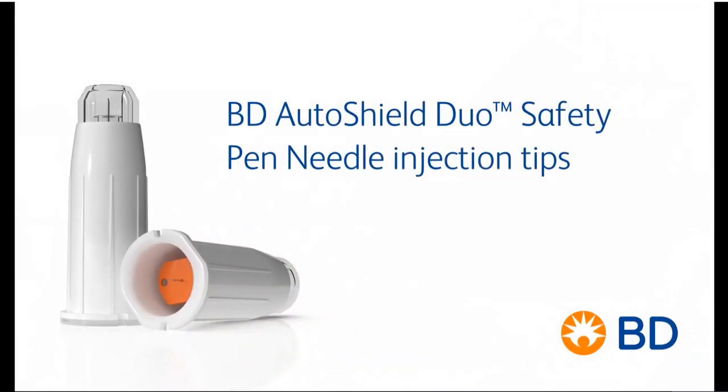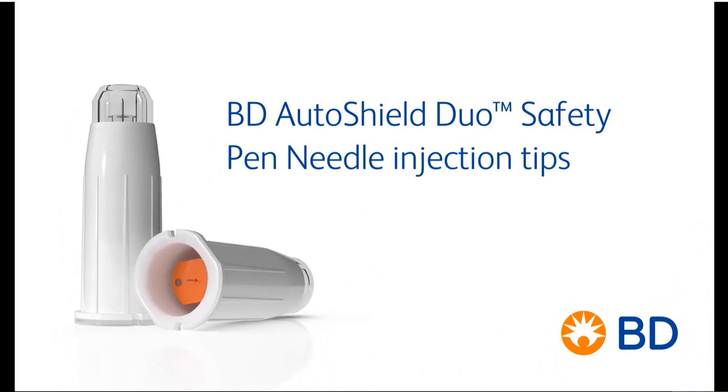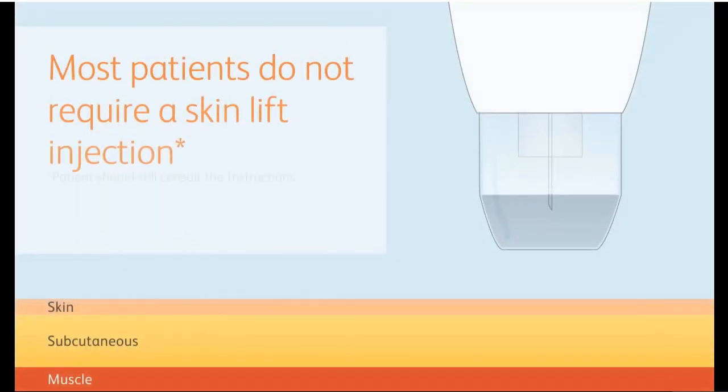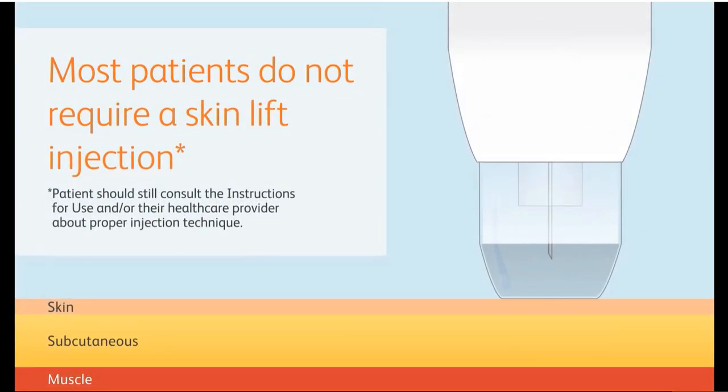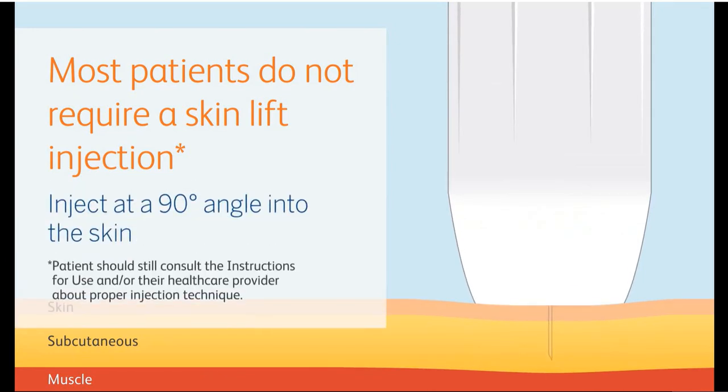To help you and your patients have more successful injections with BD AutoShield Duo, we've collected a few helpful tips and answers to common questions. Most patients do not require a skin lift with a 5mm needle. You can inject straight in at a 90-degree angle to the skin.